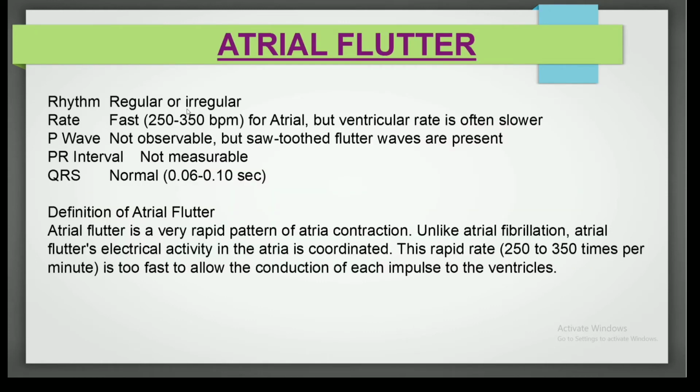The definition: its rate is very fast, 250 to 350. Its rhythm may be regular or irregular. The QRS is also normal. The atrial flutter is a very rapid pattern of atrial contraction. Unlike atrial fibrillation, atrial flutter's electrical activity in the atria is coordinated.